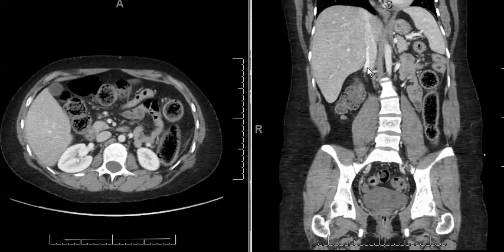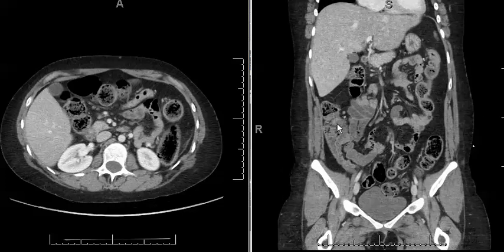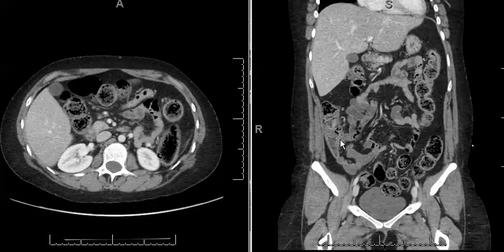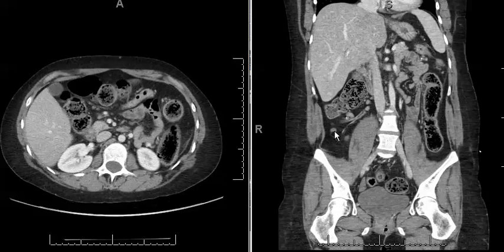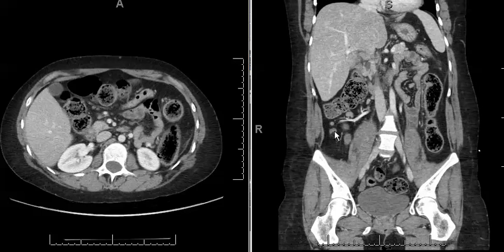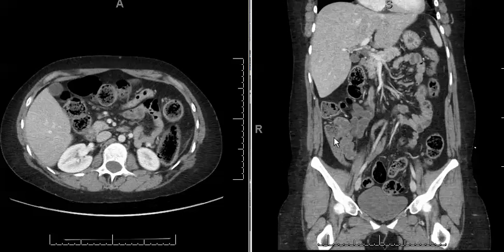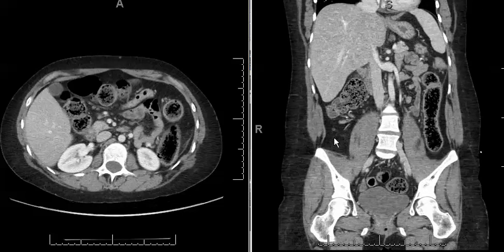When scrolling through the coronal images, we come down to the cecum and the terminal ileum here. We notice that this structure here where my arrow is represents the normal appendix. So there was no evidence of appendicitis on this scan.